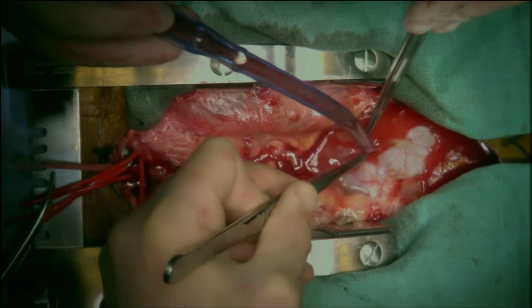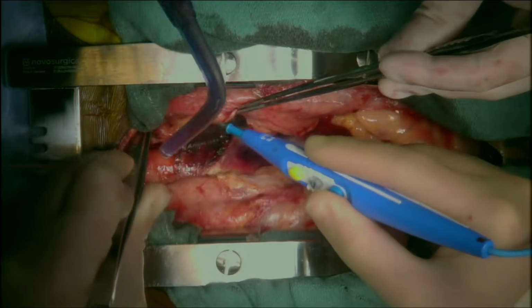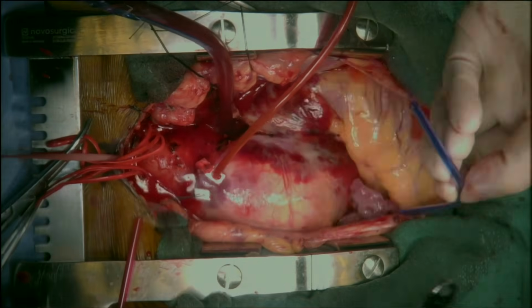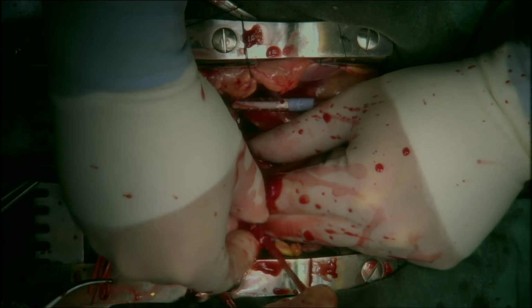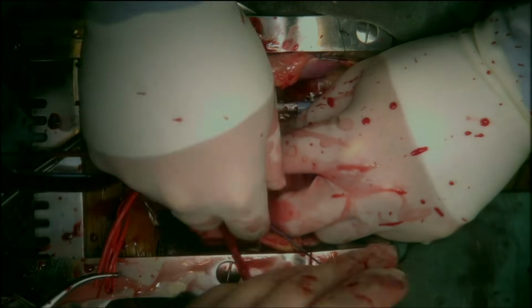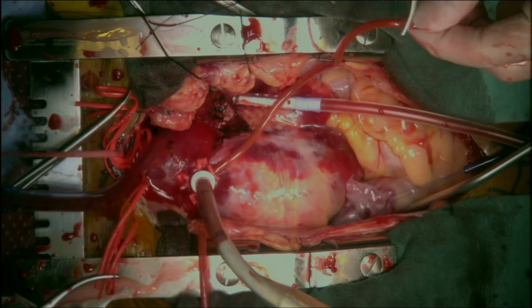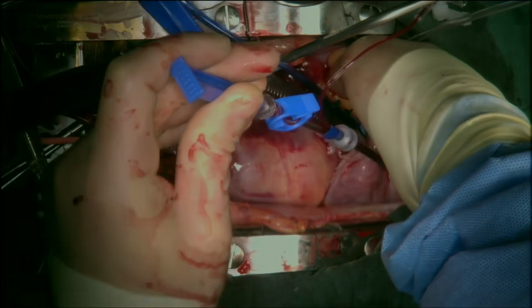Of note, transesophageal echo showed trace central AI. Systemic heparin was administered for cardiopulmonary bypass. The distal ascending aorta was accessed with a needle and Benson wire under transesophageal echo guidance and directed into the true lumen. The right atrium was cannulated with a multi-stage venous cannula. A retrograde cardioplegia catheter was inserted and cardiopulmonary bypass was initiated. An LV vent was inserted.